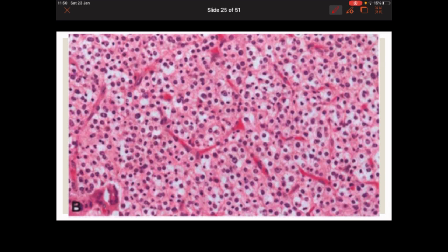Under the microscope, oligodendroglioma has specific features which you can recognize by low power. You can see that the tumor is uniform. The cells are similar in terms of size and shape, and they have fried egg features, in which there is a perinuclear halo and clear, empty cytoplasm. These appear like a fried egg, and they are so uniform. They are similar to each other.